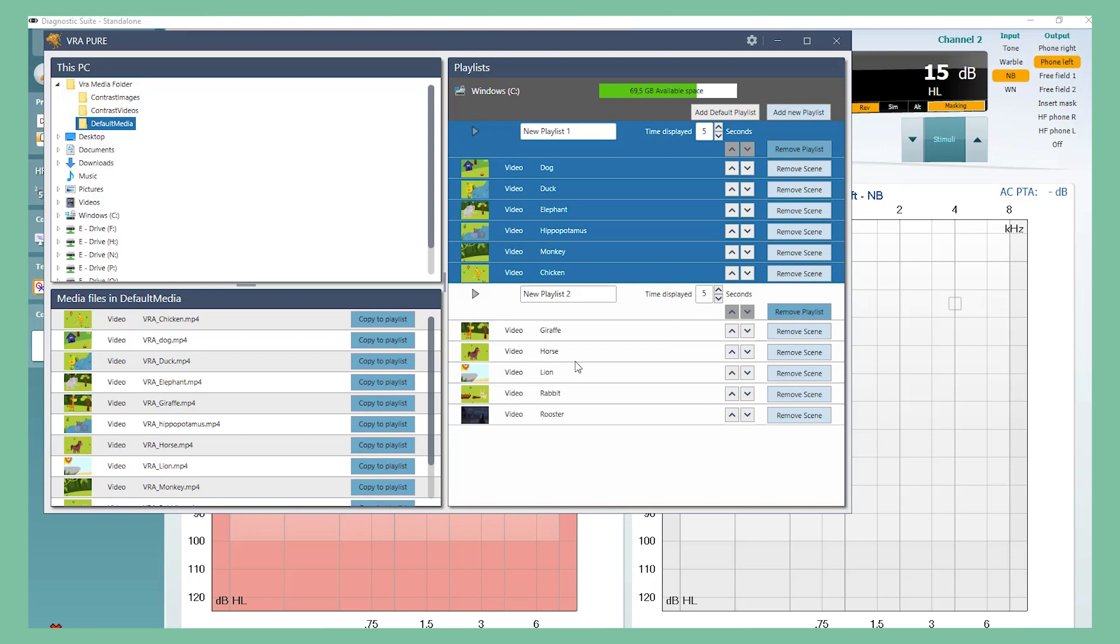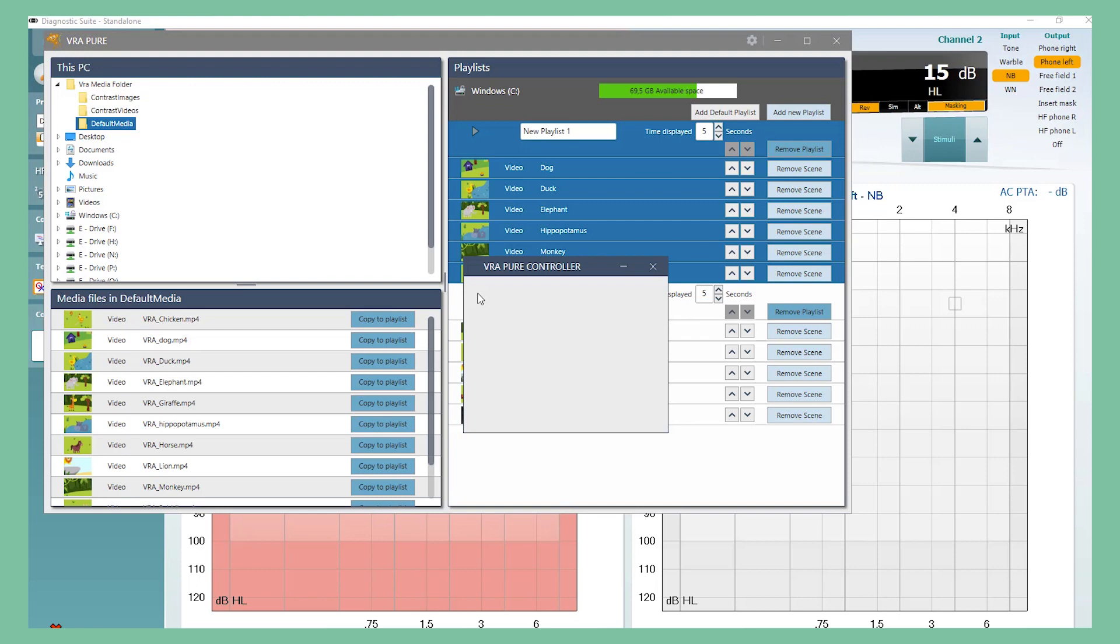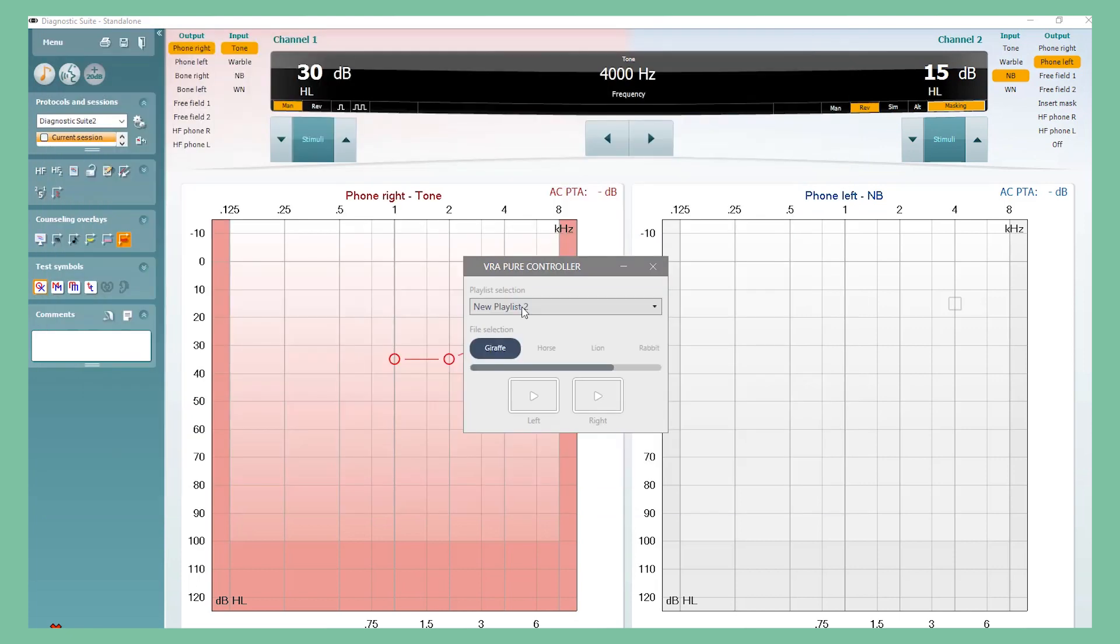When you are happy with the content of the playlists, press the play button to black out the VRA screens. You are now ready to play your chosen content.